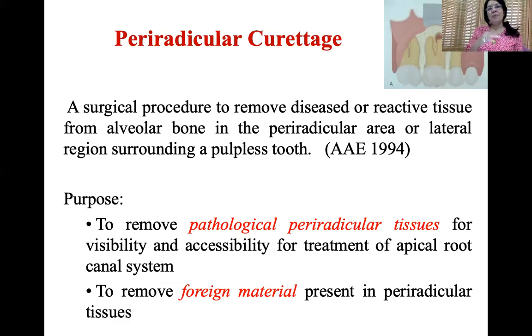Now, once you have opened the apex, here in the picture you can see you have reached the apex. The flap is lifted and reflected, held behind by these crowbar elevators, and now with the excavator you are reaching the apex and trying to clean it. The apex is cleaned because there is a pathology there.